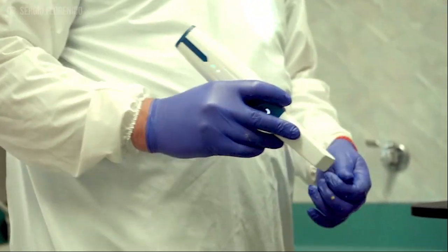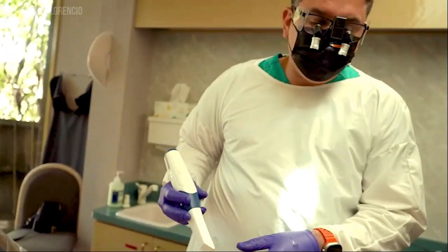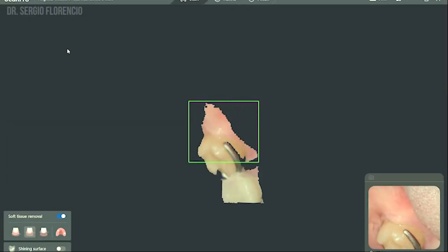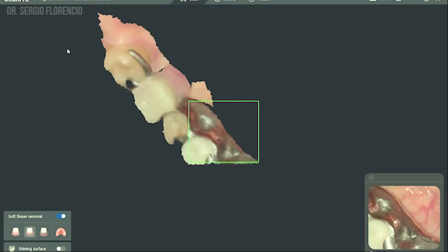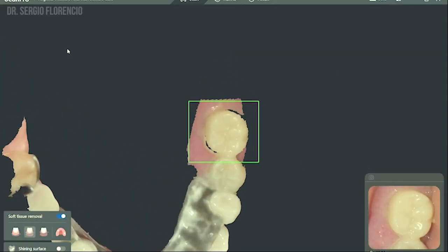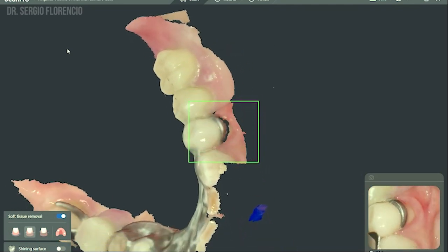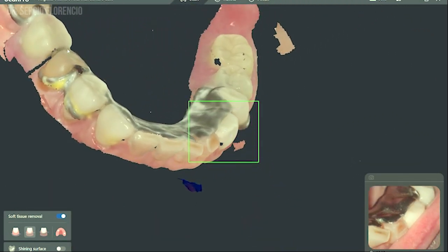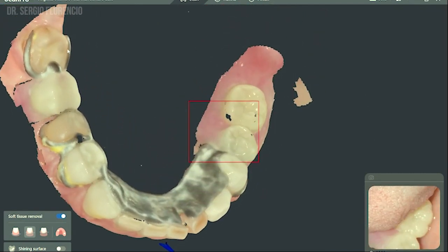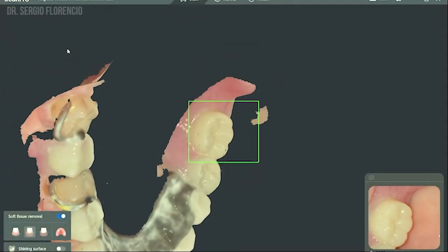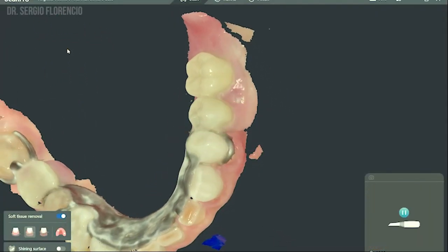Now we're going to scan the opposing arch — she has the partial in place and we'll scan that. Watch how fast this scanner handles metal without any trouble, no powder needed. Even with all those reflections, the scanner had absolutely no trouble scanning the metal. I didn't even select the shiny surface helper option — just a regular scan — and it removes artifacts very easily all by itself.